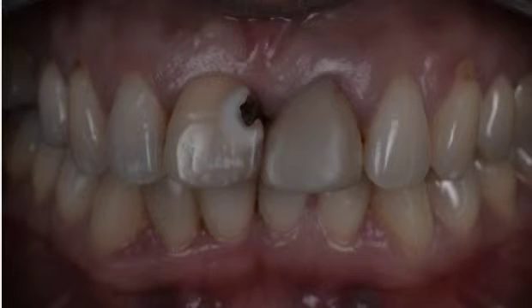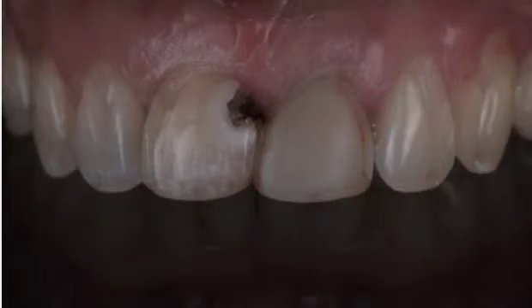Point of view. This is the smile with a more close look, and this is the digital smile design project. Very easy and very predictable stuff. The face from the side and the intraoral pictures with a close look to the problem. The right central incisor has a big decay, and the left one is restored with a composite resin restoration.